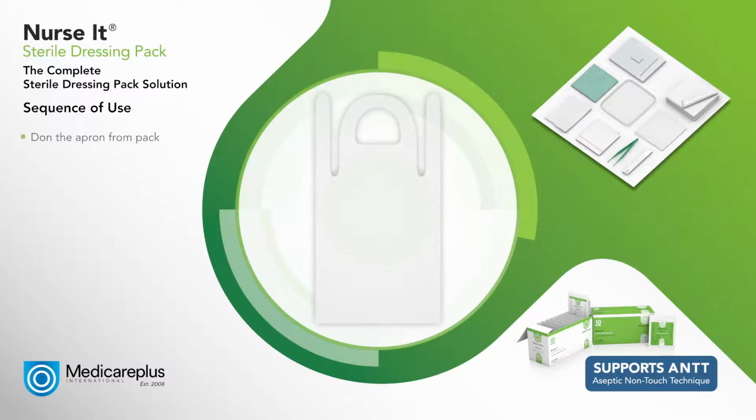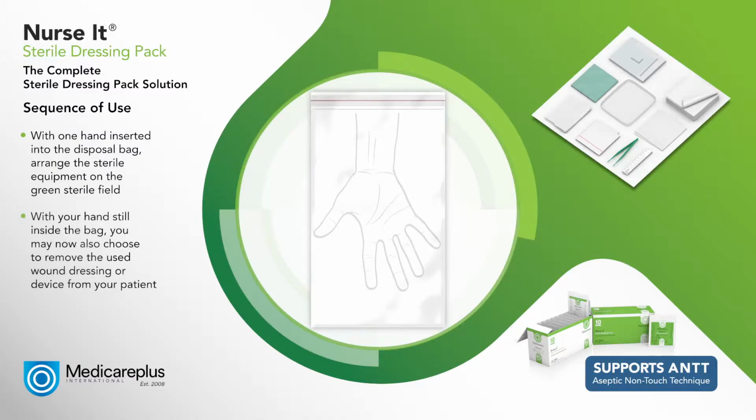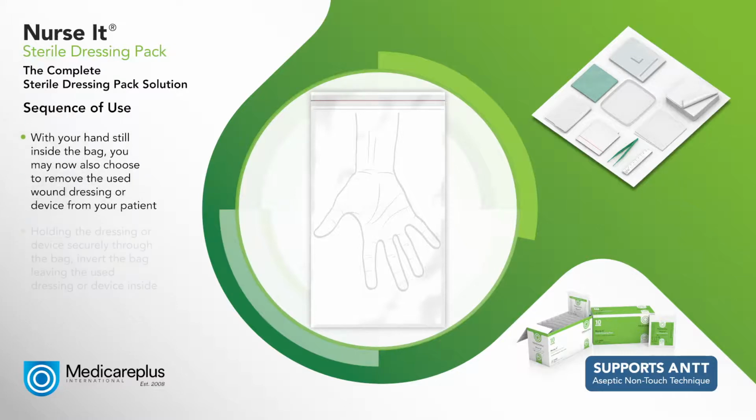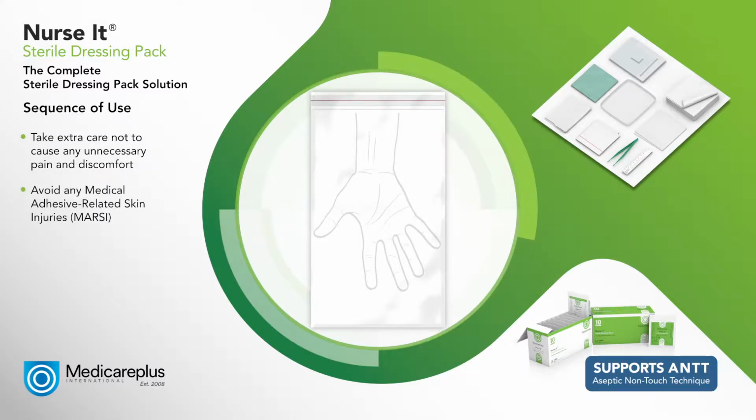Sequence of use. Don the apron from the pack. Then, with one hand inserted into the disposal bag, arrange the sterile equipment on the green sterile field. With your hand still in the bag, you may now also choose to remove the used wound dressing or device from your patient. Holding the dressing or device securely through the bag, invert the bag, leaving the used dressing or device inside. When removing the used dressing or device, take extra care not to cause any unnecessary pain, discomfort, or medical adhesive related skin injuries, such as skin stripping.